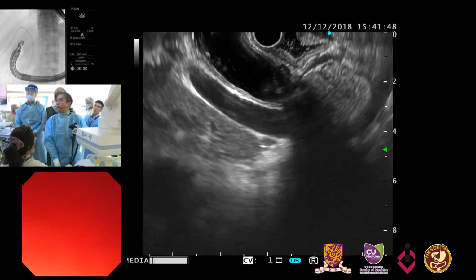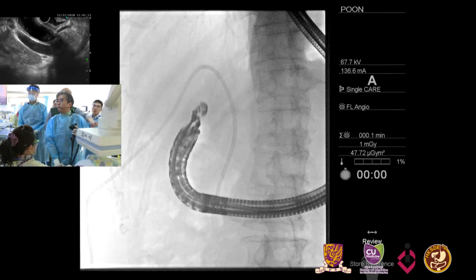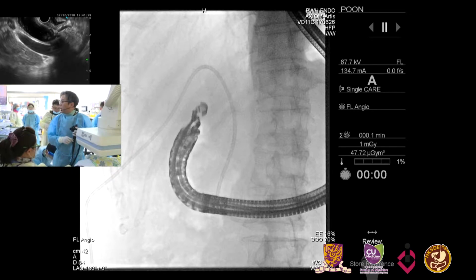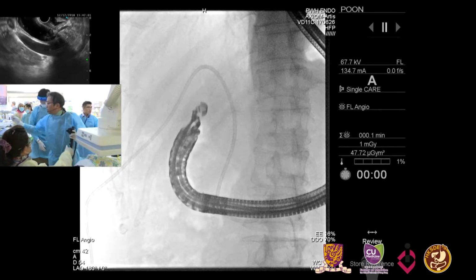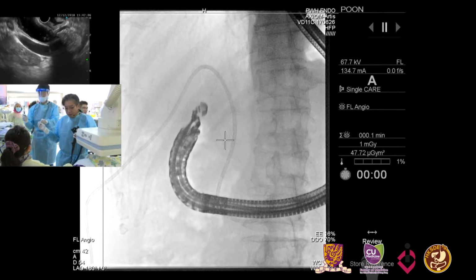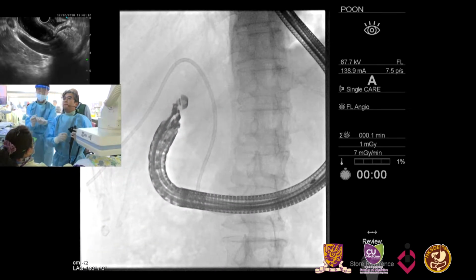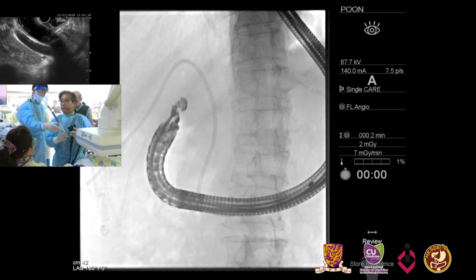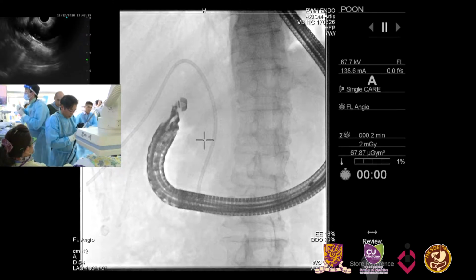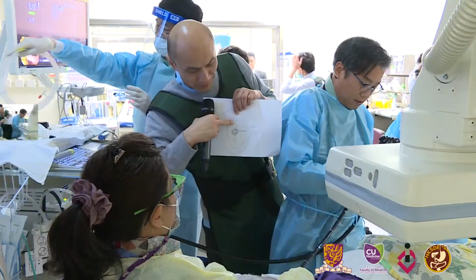So in this patient, fluoroscope, please. You can see the long scope position, and the tip of the probe is towards the hepatic hilum. It's the ideal position. So I'd like to perform the US-guided needle puncture. So this patient is in a prone position? Yeah, prone position. And Anthony, can you show us again where on the diagram the scope is right now? Is that your drawing, Anthony? Yep, I'm coming. Wait a minute. Okay, the scope is right here.